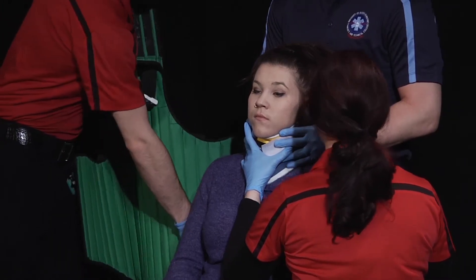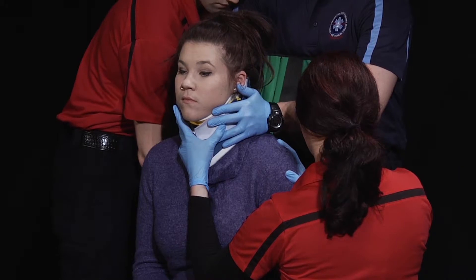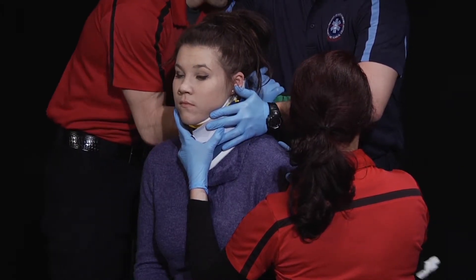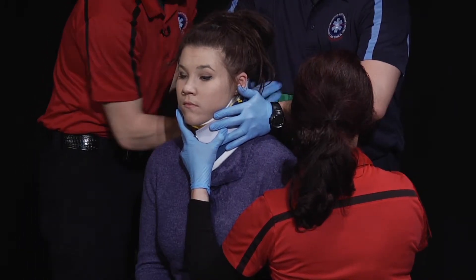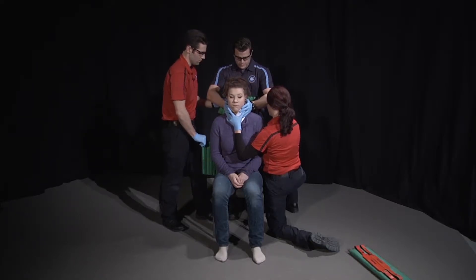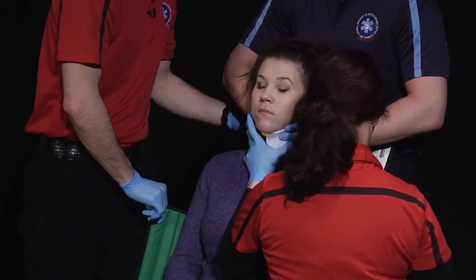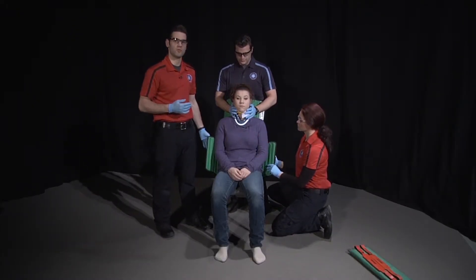Ready? One, two, three. And again on head's count, we'll move the patient back. Ready? One, two, three.